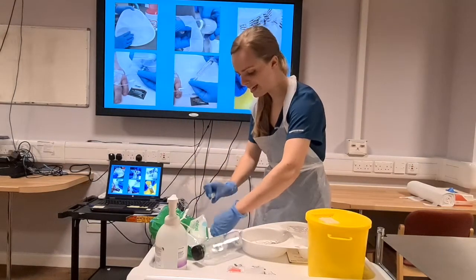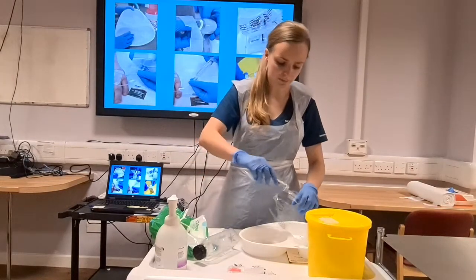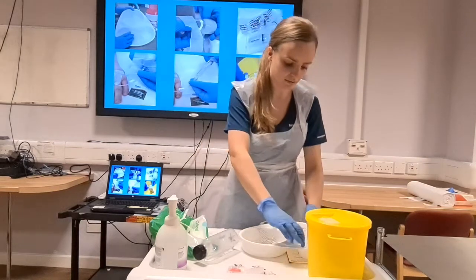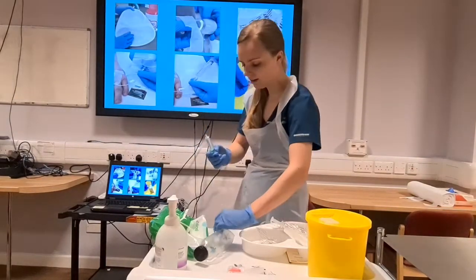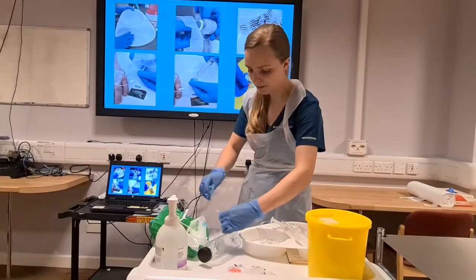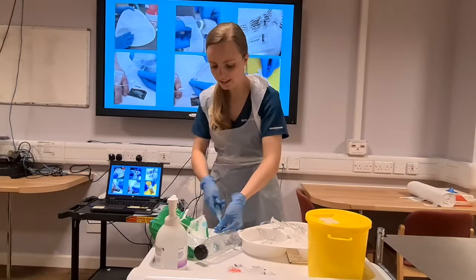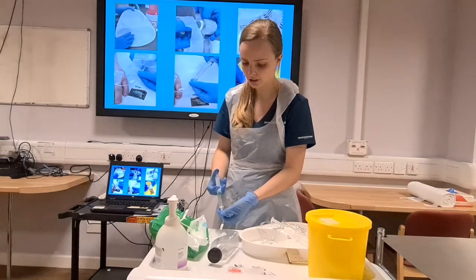Placing your cannula down, like so. Putting my flush back into my packaging to protect my key part. Always remember that. Then I pick up my medication and place my medication in, going as quickly or as slowly as the guidance tells me to. So I'm just going to slowly go.